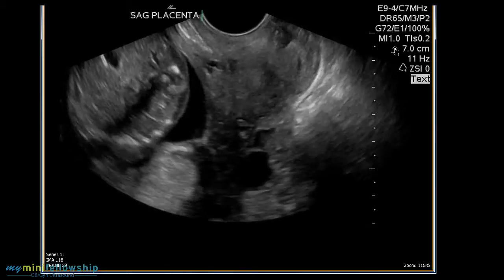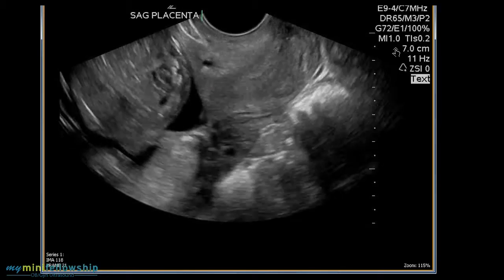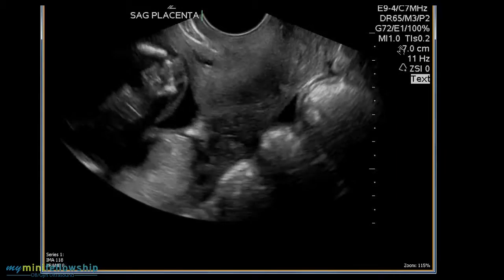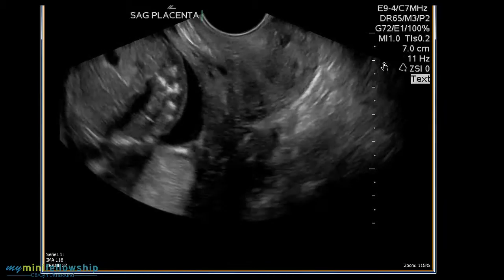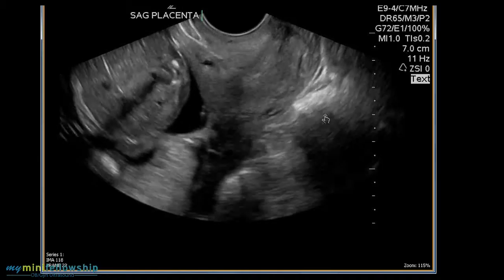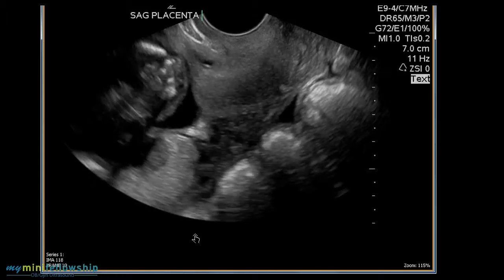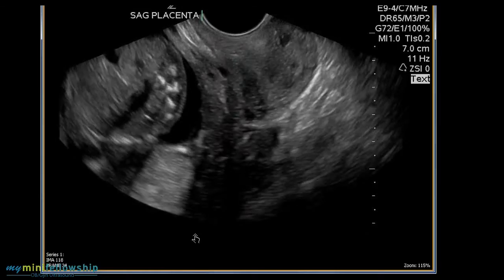Do you use the term low-lying at all? Yes, I do use the term low-lying, and the reason is not that I'm concerned that it will be an obstruction at later times or that any placenta in the history of the world ever migrated toward the cervix. But low-lying placentas are a cause of bleeding. There's really no question about it, so it is always worth mentioning. Okay, great. So you think circumvallate? Circumvallate, and low enough to mention the word marginal previa in your report.